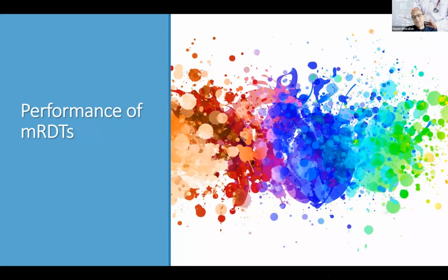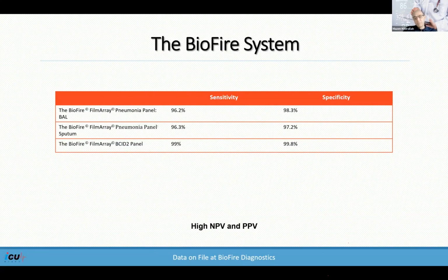So how do these tests perform? Again, based on the data that is available at the company, and here we have the BioFire system.